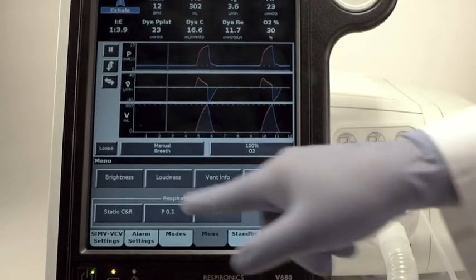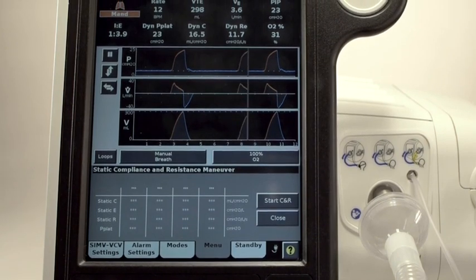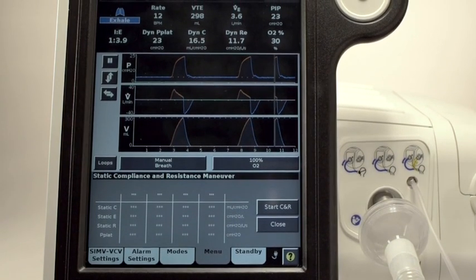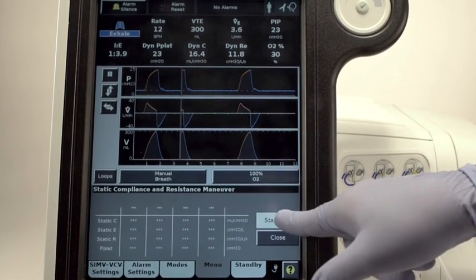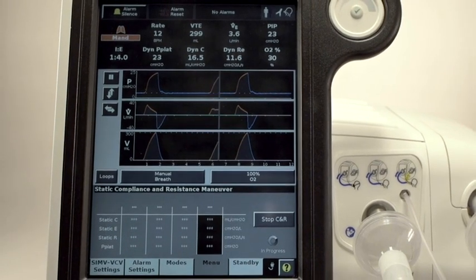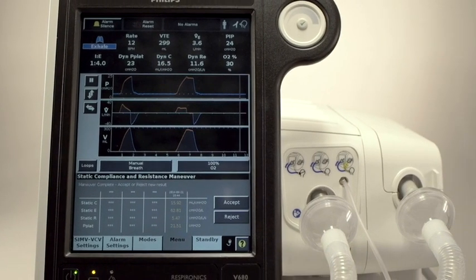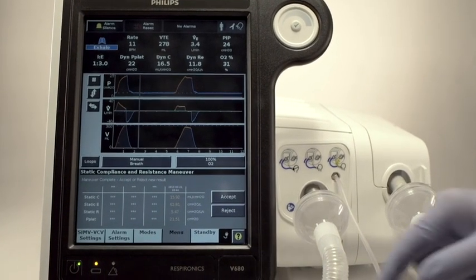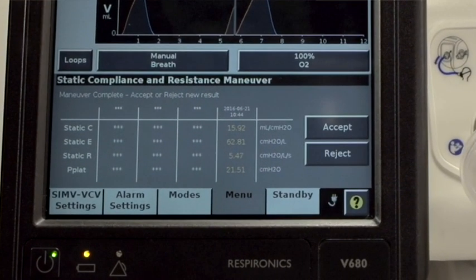The window opens for the static compliance and resistance tests. The static pressure maneuver has long been considered the gold standard for measuring plateau pressure. Touch Start CNR and V680 will initiate an inspiratory pause long enough to obtain a stable static environment and then measure the plateau pressure, static compliance, static resistance, and static elastance. Note the static plateau pressure measurement and compare this to the value you noted for the dynamic plateau pressure prior to the start of the static maneuver. The two measurements should be within plus or minus one centimeter of water of each other.